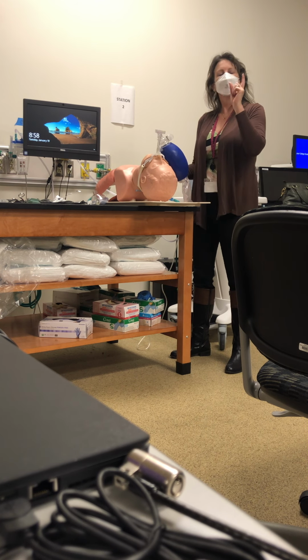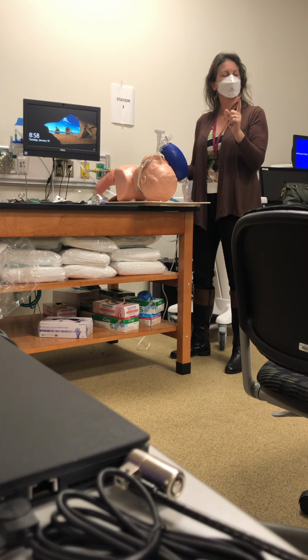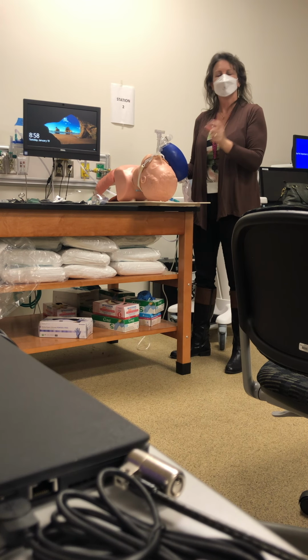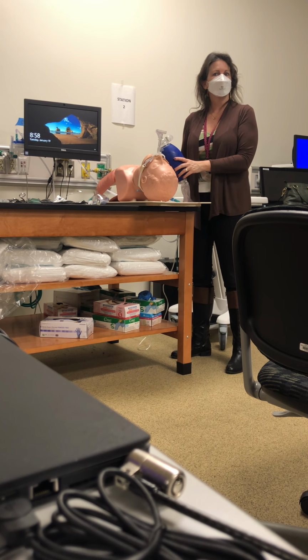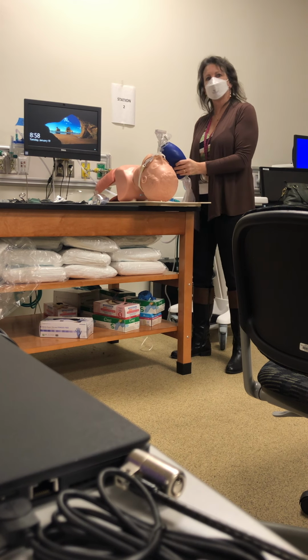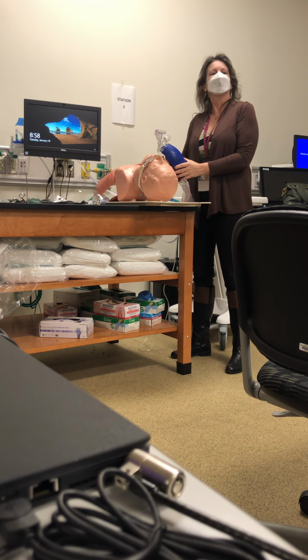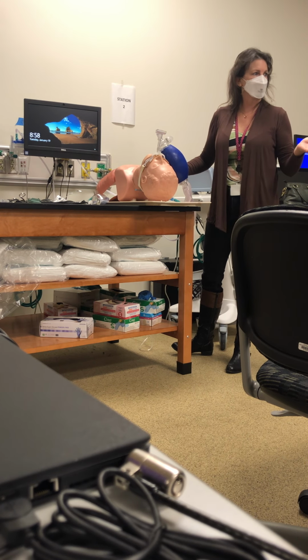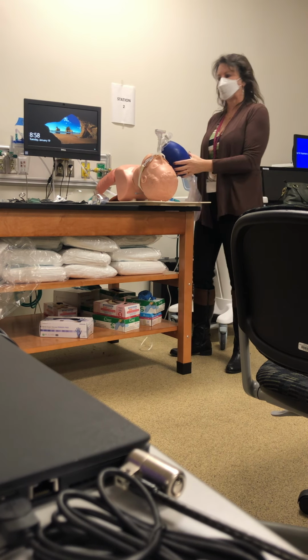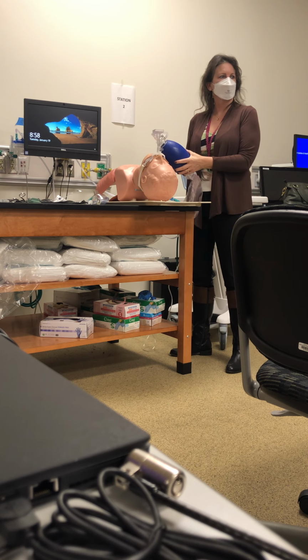So, the quickest way to determine if you've intubated in the trachea is to see chest rise. I will ask you that. What is the quickest way to see the endotracheal tube is in the correct placement? Because you're observing for chest rise. The best way and most efficient is to get a chest x-ray. But the quickest way is to see the chest rise.